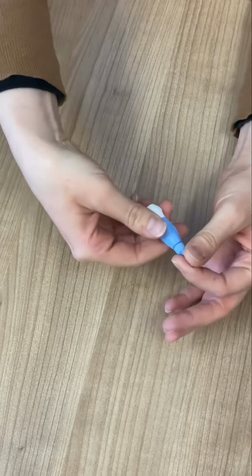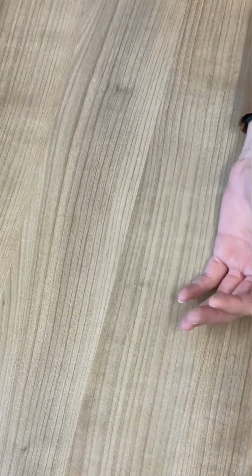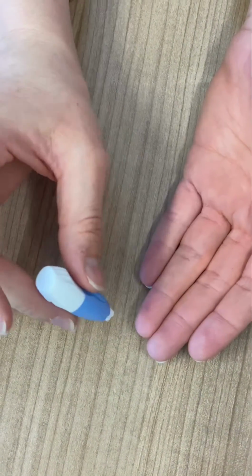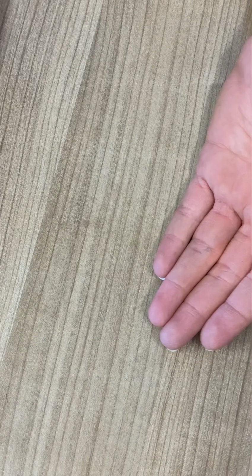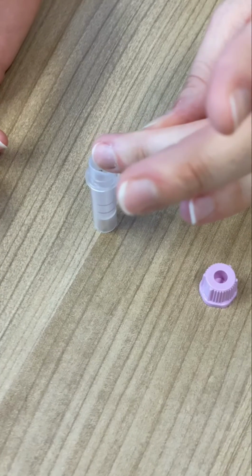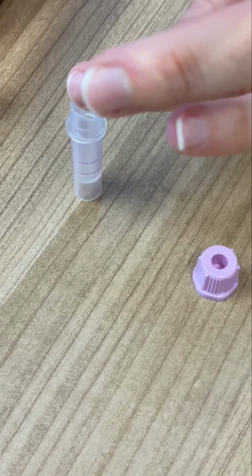Take a lancet and twist and pull the top off, and then to prick your finger, lay your hand on a flat surface, press the lancet firmly into the middle or side of your fingertip to make a small cut. Keeping your arm straight, massage down your finger, allowing drops of blood to fall into the tube. If your blood stops flowing, prick another finger.